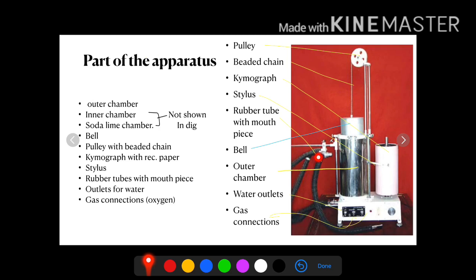There is a kymograph attached to this instrument, which is a recording device, and a stylus is attached to it. A paper is wrapped around the kymograph where the recording is to be done. Now there are three knobs on the bottom of the instrument — one is for the outlet of water, so water can be drained out, and the others are for gas.